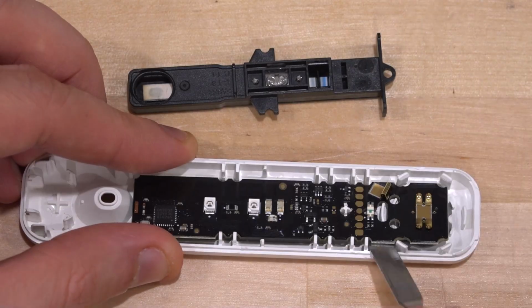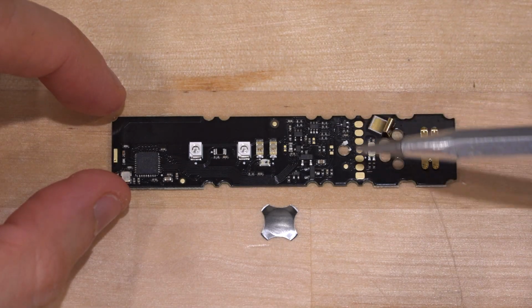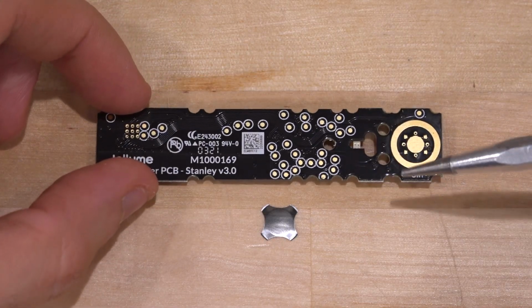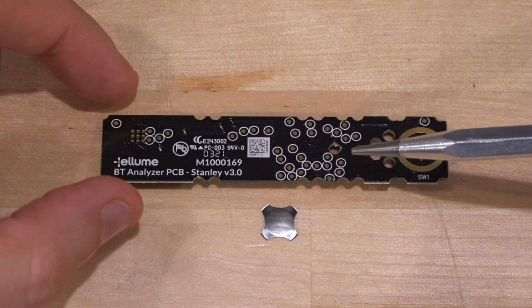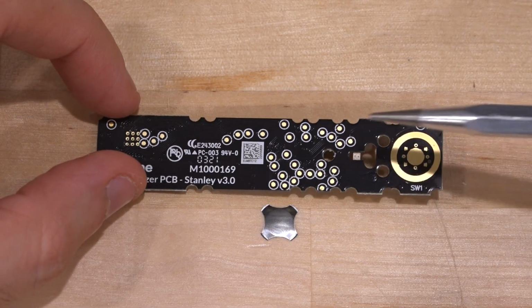It's going to be difficult to take this off on camera. So here's the board outside. We can see some pads in here, probably for factory programming or testing, but there's quite a few more on the other side for a bed of nails tester. These obviously have to go through rigorous testing to make sure that all the electronics are okay and that also the appropriate serial number and everything's programmed in there before they leave the factory.